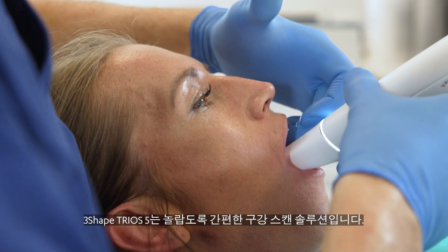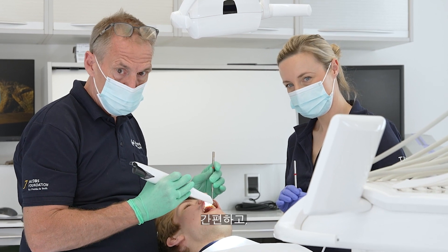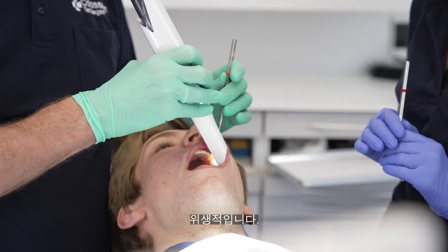3Shape Trios 5 is intraoral scanning made simple. It's simply ergonomic, simply effortless, and simply hygienic.